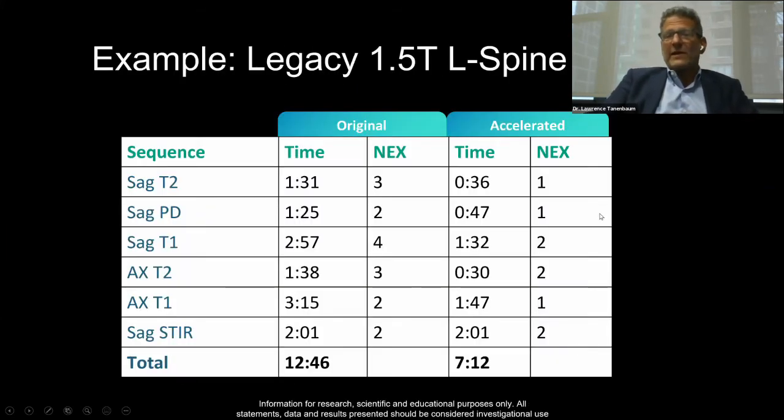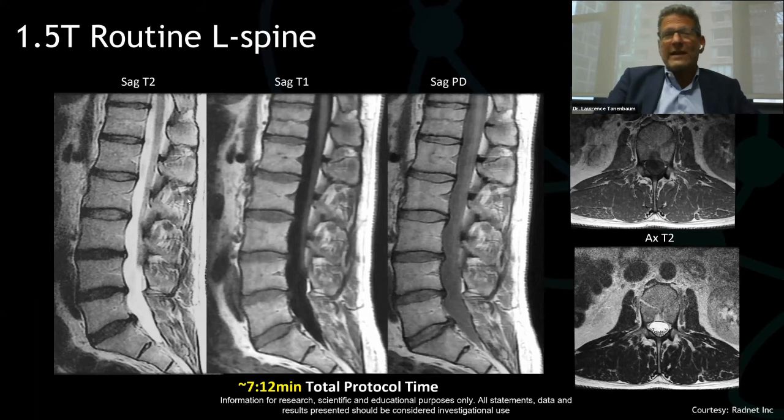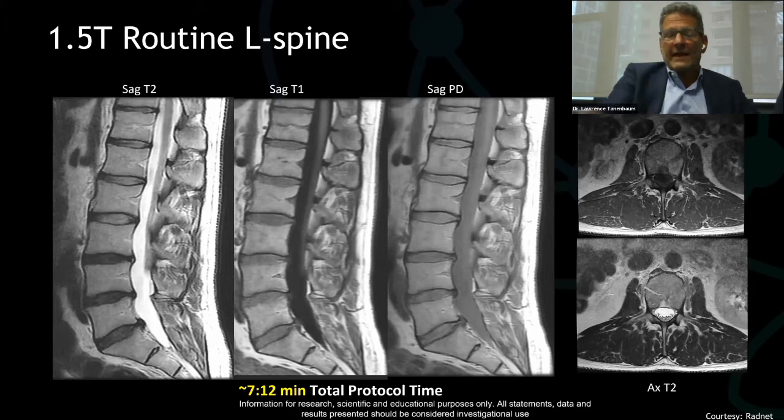As an example, here's what we did with our accelerated protocols. And you can see that this is a lot faster than we did beforehand. So how did we accomplish the image quality that we had before? Well, we can use these tools to take this type of quality. You can see it's got a little low SNR, a little noise, it's just not an ideal image. Even though we've achieved our clinical goal of a 20-minute exam slot, we can actually use these tools to bring the quality back. Again, still maintaining that exam slot, but maintaining the quality we're expecting.